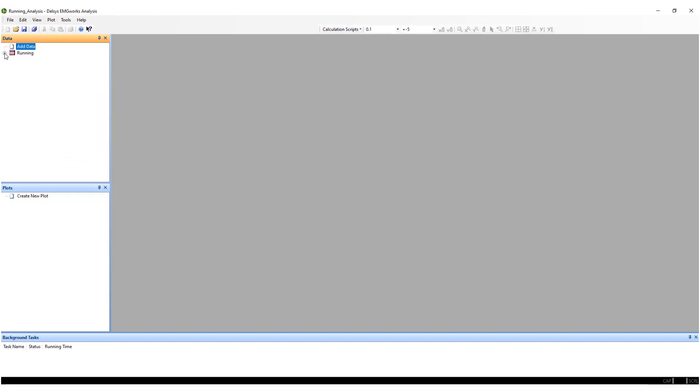There are various options to plot your data. To plot all the data within the file, select the data file.